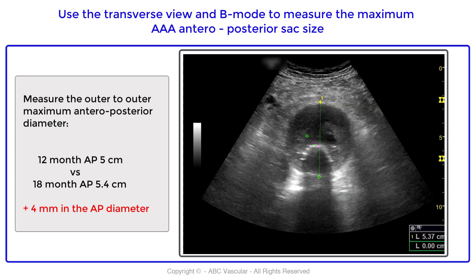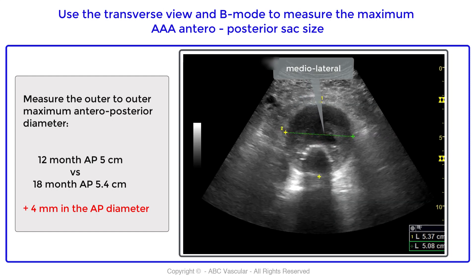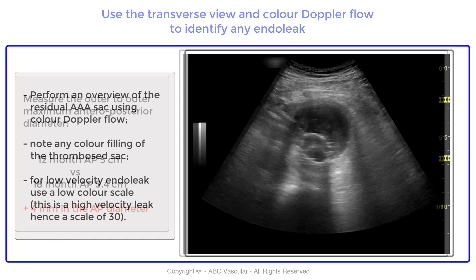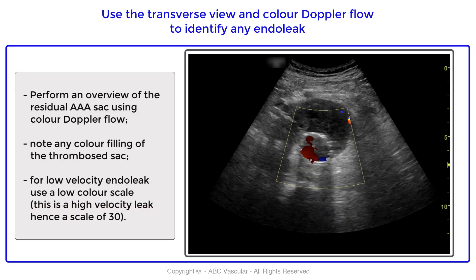We can also measure the medial-lateral diameter as the walls are clear. This confirms a 4 mm sac size increase compared to the annual follow-up ultrasound.